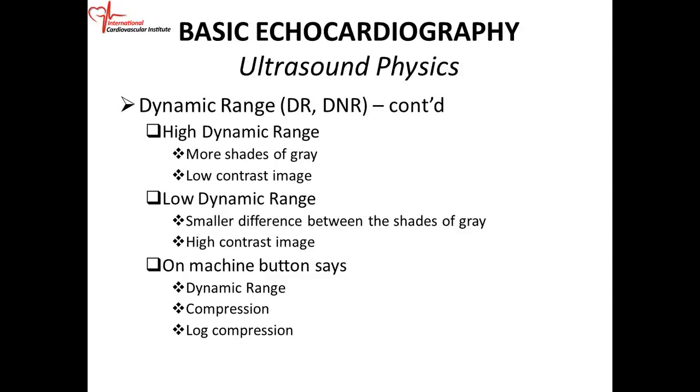As mentioned before, you're going to see the frequency of the probe you're using, and unless you're doing vascular or TE, it's usually between 2 and 5, so you say 2 to 5 megahertz. The temporal resolution is going to be there, usually in frames per second, or sometimes they just put hertz. They might put 50 frames per second. That means in 1 second you have 50 frames, as we'll show you how to work out temporal resolution.